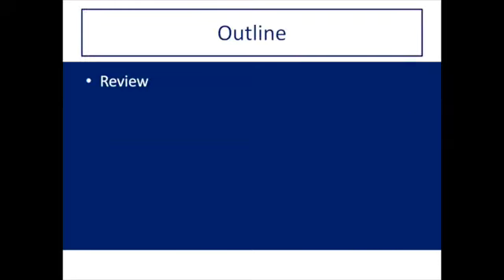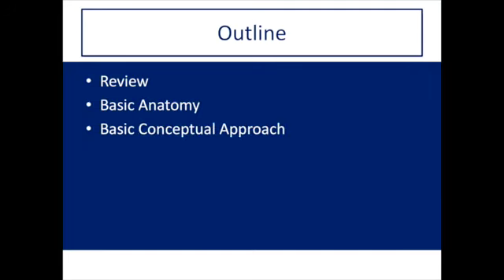To start off, we will briefly review some key concepts, discuss some basic relevant anatomy, and then we're going to get right into it by introducing you to a conceptual approach to CT scan. We will then introduce some basic key concepts, really just what you need to know to start looking at CT scans right away and efficiently.